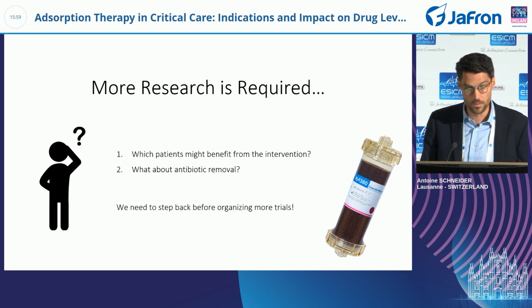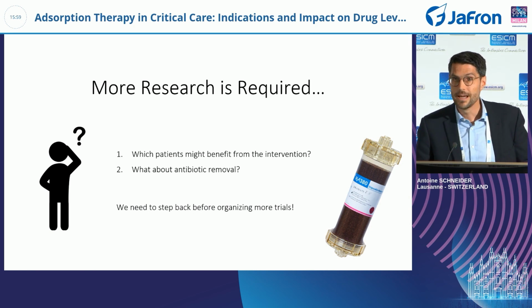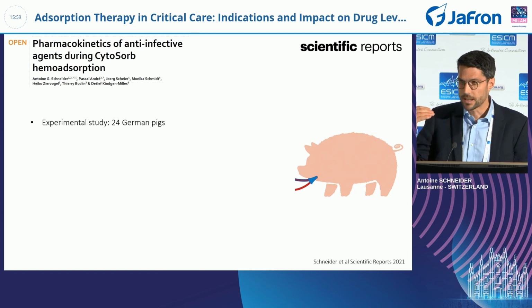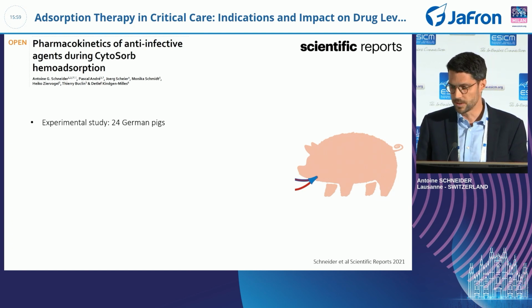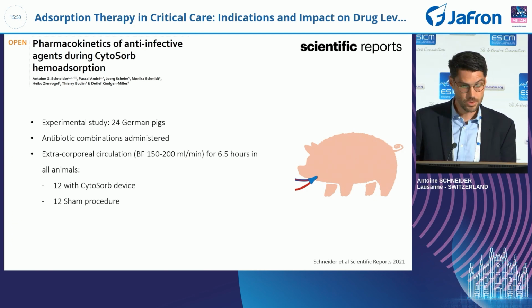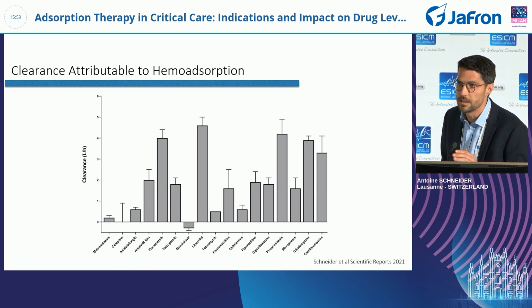So what about drug removal? What about antibiotic removal? And I think at this stage, before we start organizing more trials, we have to step back and look at physiology and understand how this all works. So this is a work we did a few years ago with CytoSorb, where we looked at the capacity of this filter, this adsorber, to remove the antibiotics. There was a study conducted with 24 German pigs, and we administered some combinations of antibiotics to these animals, and we performed to 12 of them a CytoSorb adsorption and 12 of them a sham procedure. And of course, we did some blood samples, and the key thing I want to bring here is the following.